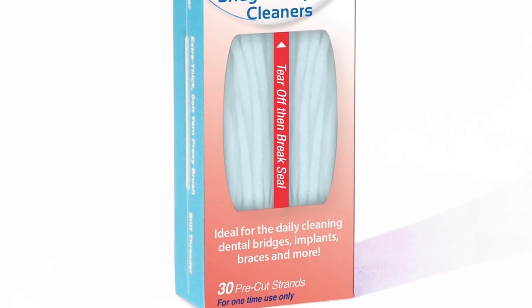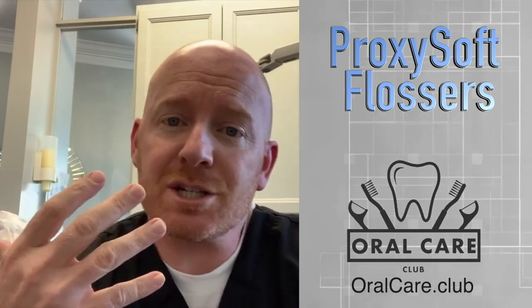Proxisoft Bridges and Implant Cleaners. If you have bridges, you know that stuff can get up underneath and it's hard to get floss underneath bridges, top or bottom. It's hard to get stuff in there to clean out what's underneath.